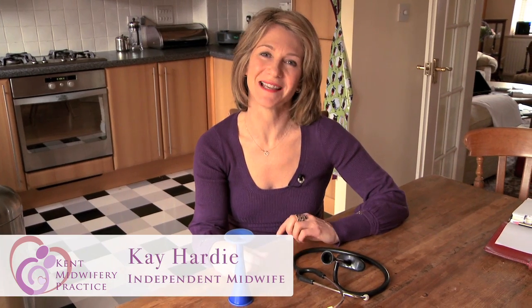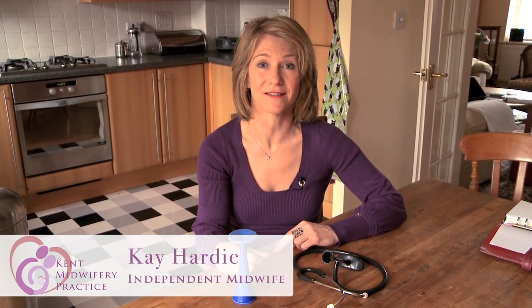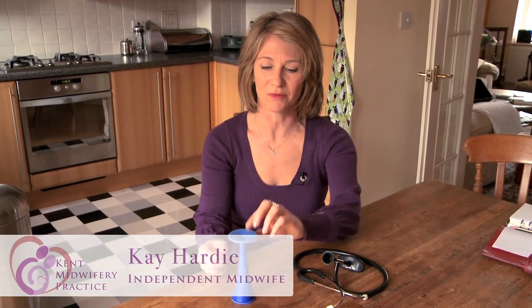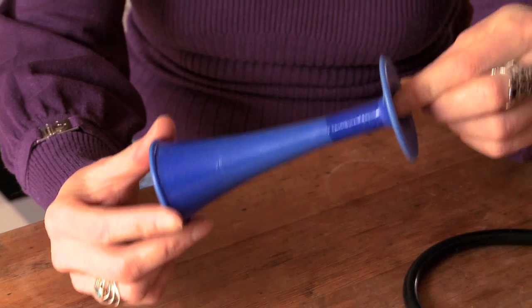Hello. Today I'm going to visit Louise, a pregnant client, and listen to her baby's heartbeat with a fetal stethoscope. I've got two examples here. This one is the more traditional midwives' fetal stethoscope. It's called a pinnards.